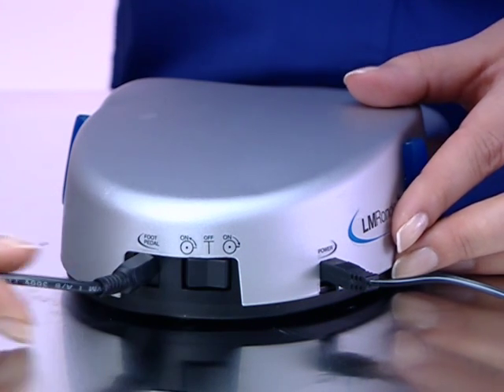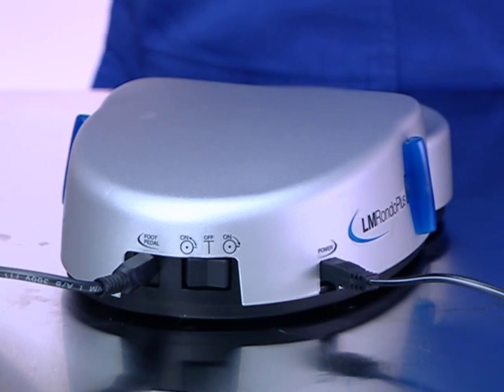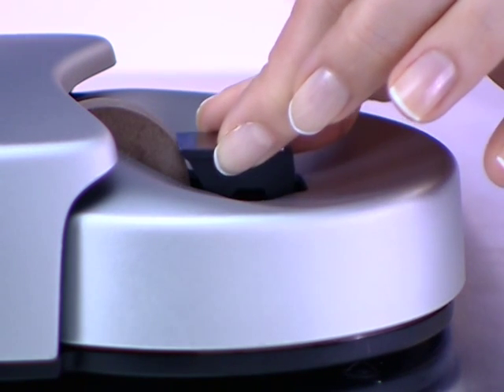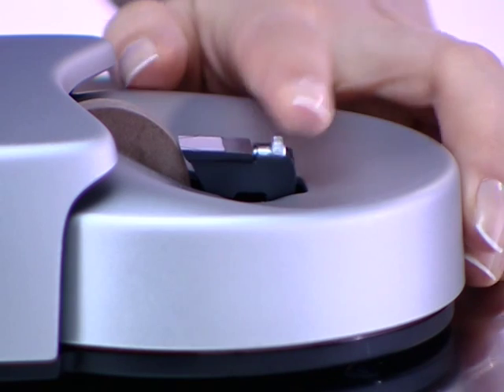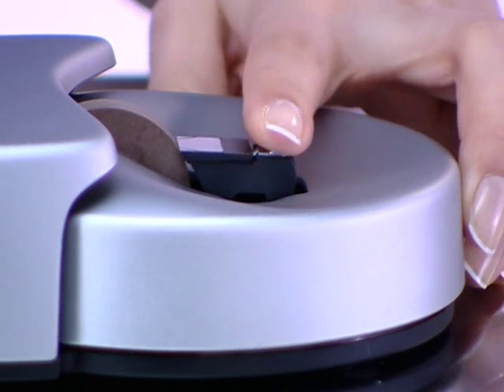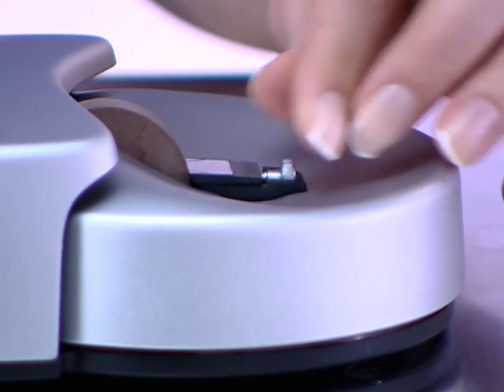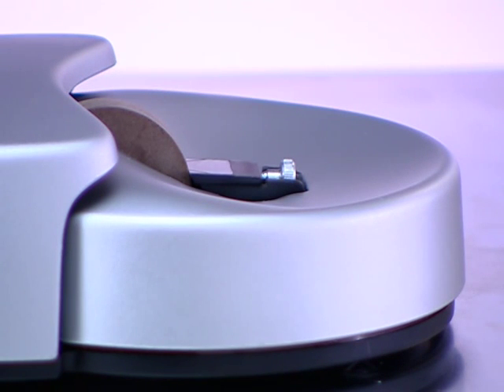The machine will only operate when the pedal is depressed. Before sharpening, slide the instrument rest as close to the sharpening stone as possible, especially after changing stones. The lower instrument rest position is for all periodontal instruments, while the upper rest is for preparation instruments.